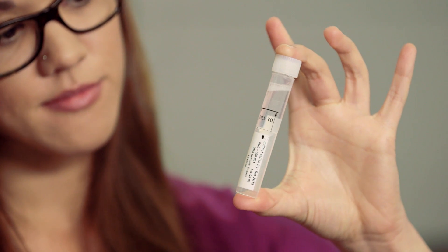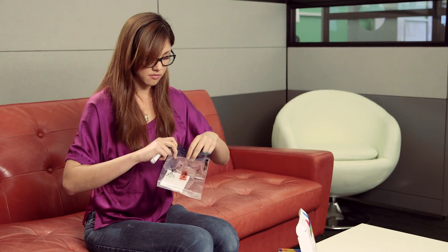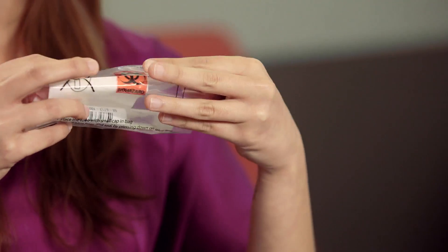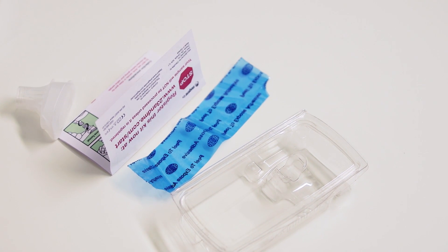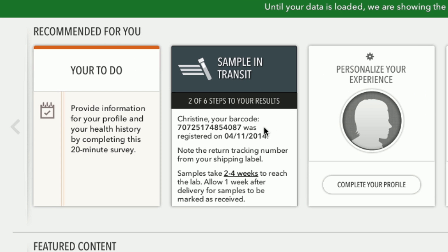Now your DNA is ready for transport. Open up the biohazard bag and place the tube inside. Remove the adhesive backing and seal the bag shut. Place the bag directly inside the box. The plastic clamshell, instructions, and funnel cap can all be discarded. Seal the box and place it in any USPS mailbox or take it to your post office. You can track the progress of your sample by logging into your 23andMe account and finding the sample status information located there.